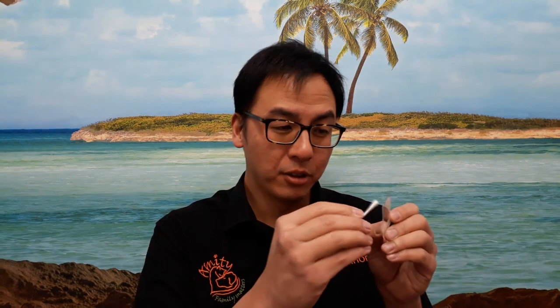I smear it onto the slide. If I go to the right ear first, I'll write an R on the slide — R for right. After the left ear, on the other side of the cotton bud, I'll smear it on the other side. So one side is right and the other by default is left. This is what I call cytology — ear cytology to be more exact.